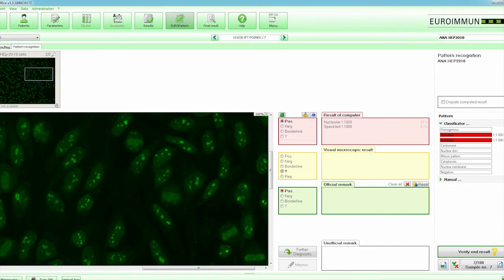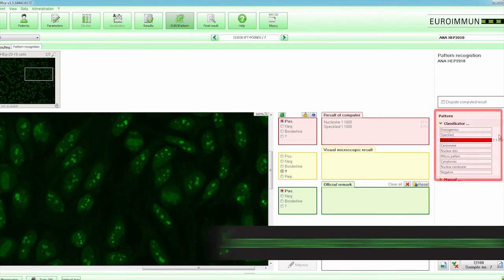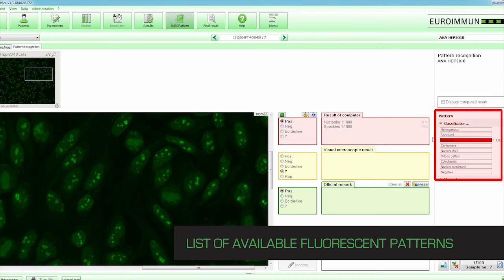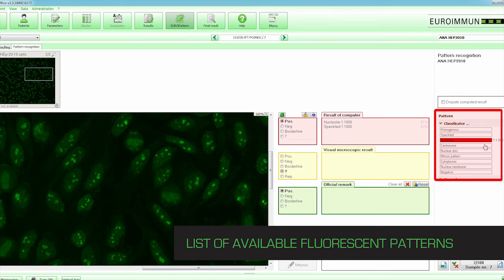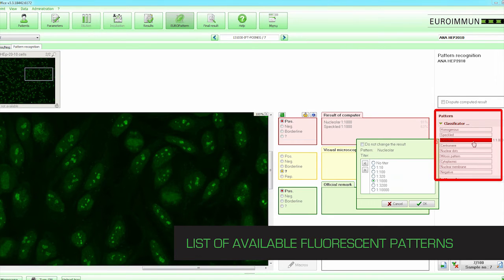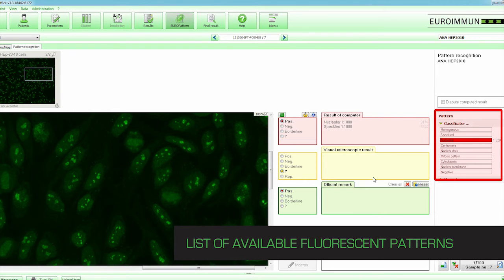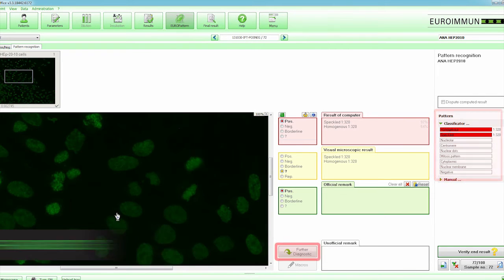The automated result is also displayed in the list of available fluorescent patterns. An identified pattern can be included into the result by activating the tick box next to the pattern name, after which a window opens allowing the technologist to select the required titer. Additional patterns can be added or removed by the laboratory technologist.